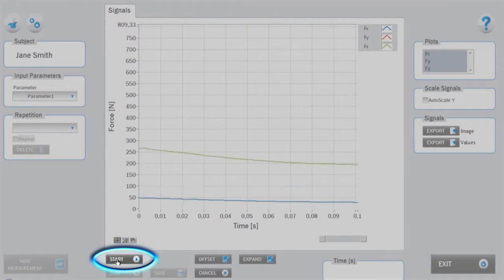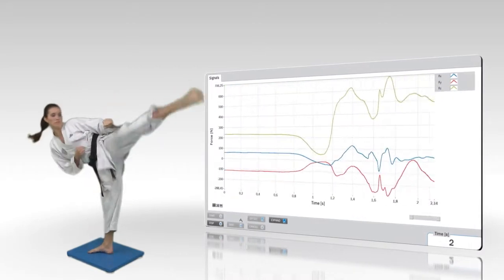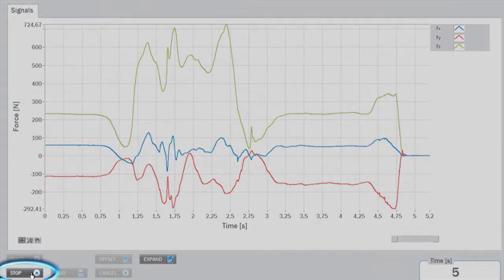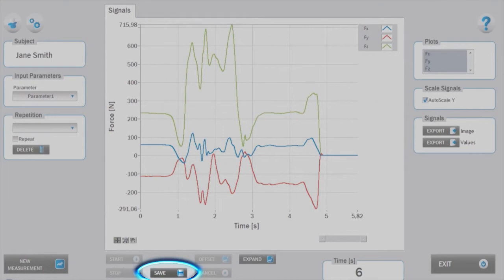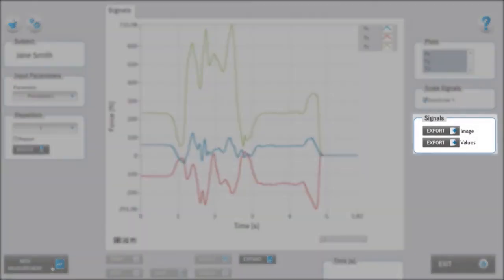Initiate the measurement by pressing start. The subject then performs the movement — in our case the karate kick. The measurement stops after pressing the stop button in the lower panel. If you are satisfied with the measurement, you can save it. Force signals can be exported from the right analysis panel.